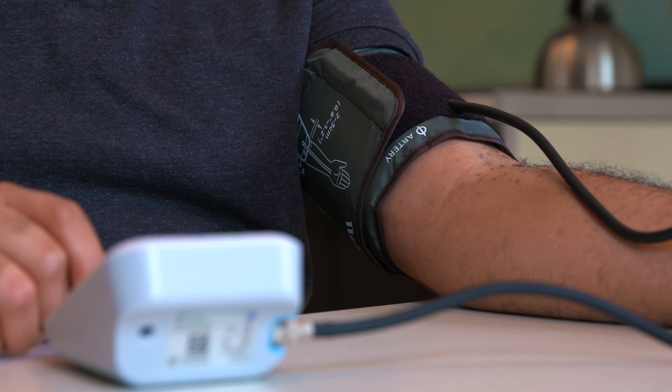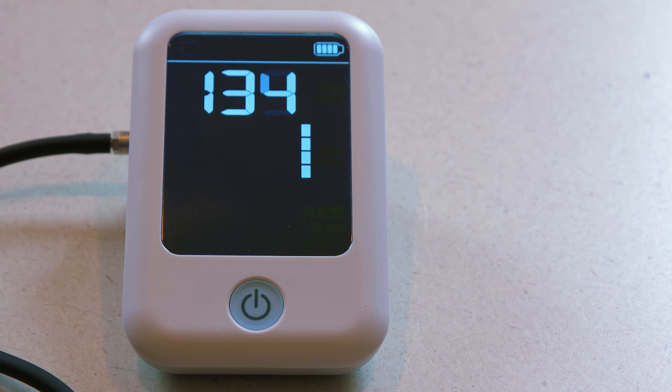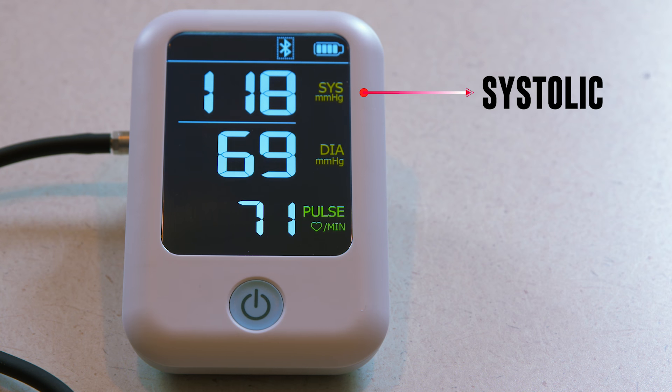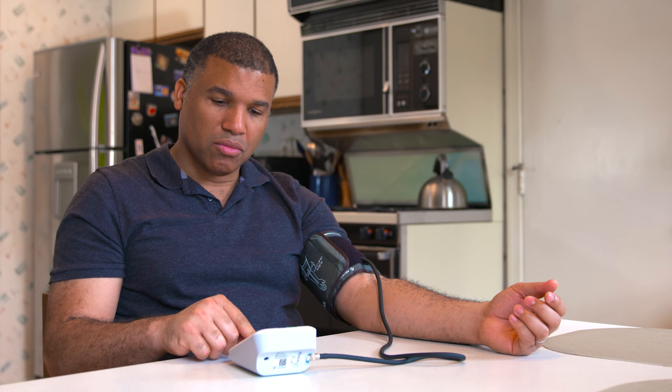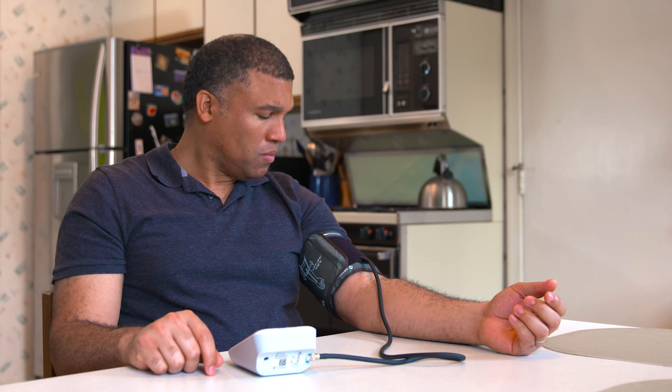When the monitor is finished taking your blood pressure, you will see two numbers. The top number is systolic blood pressure, which shows the pressure in your arteries when your heart beats. The bottom number is diastolic blood pressure, which is the pressure in the arteries when your heart is at rest. It is ideal to take at least two readings in the morning and in the evening, one minute apart, but follow your healthcare provider's instructions.